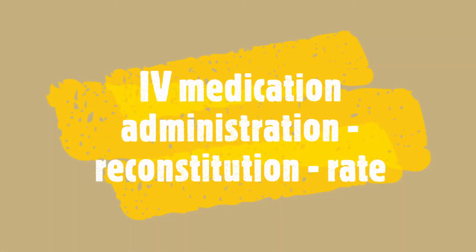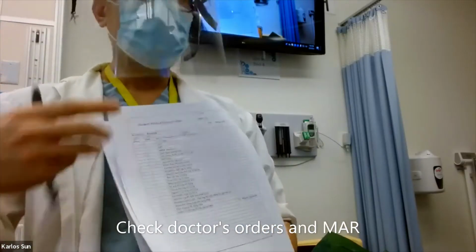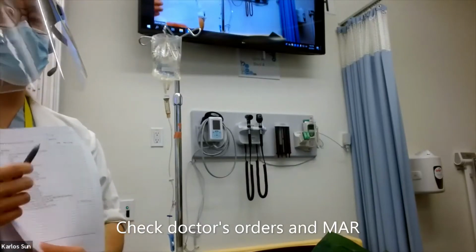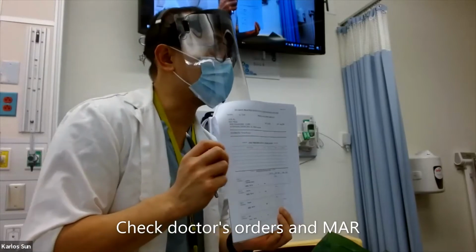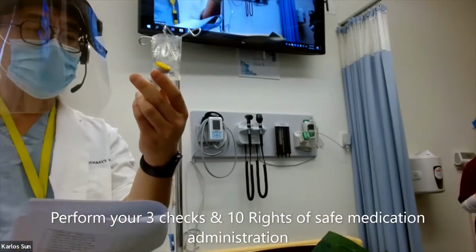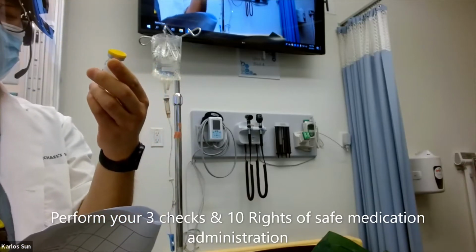In today's video, I'm gonna go over IV medication administration, reconstitution, and setting a rate. Start by checking the doctor's order and the medication administration record. Now perform your 3 checks and 10 rights of safe medication administration.